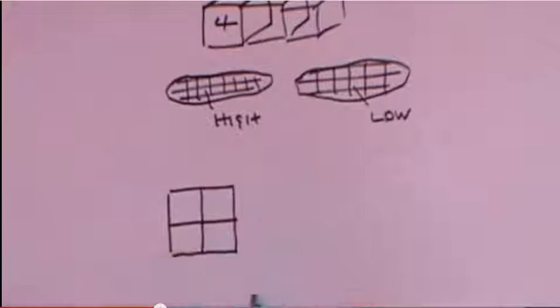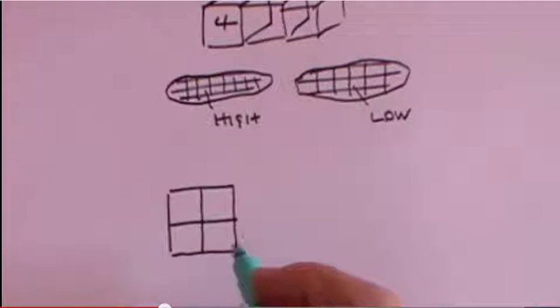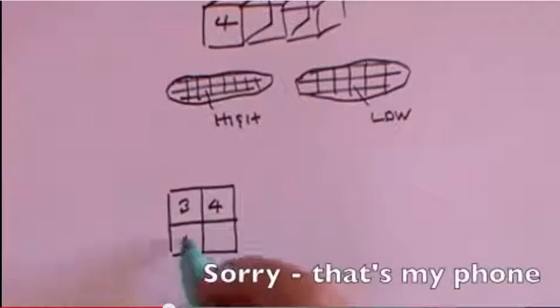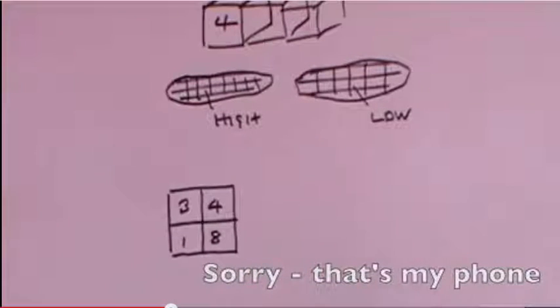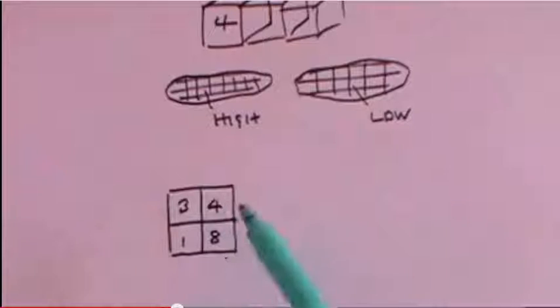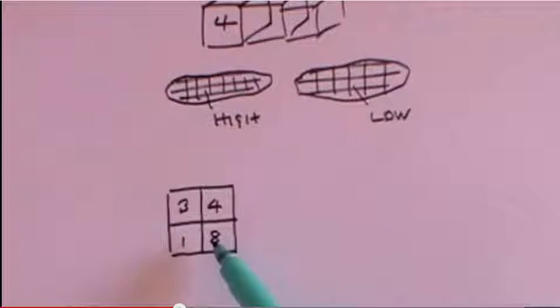Then the voxel has all the information of different constants of attenuation of different tissues. We can have different values, and what the algorithm does is that, depending on the position of the beam, where the beam passes, we have different sums of the values. I mean, for example, 4 plus 1 or 3 plus 1 or 8 plus 1, and it depends on the angle of the beam and the orientation.